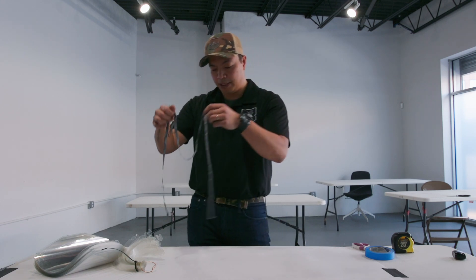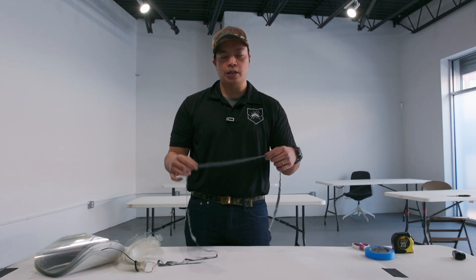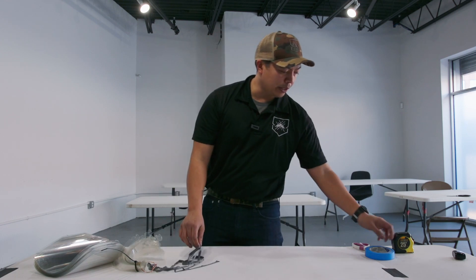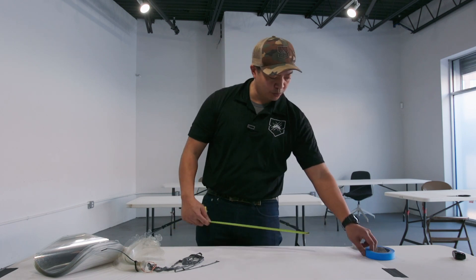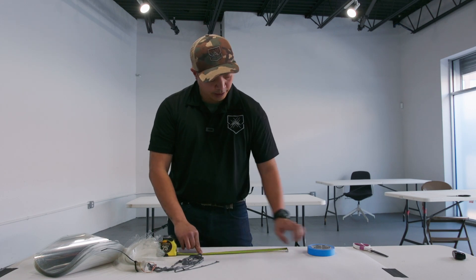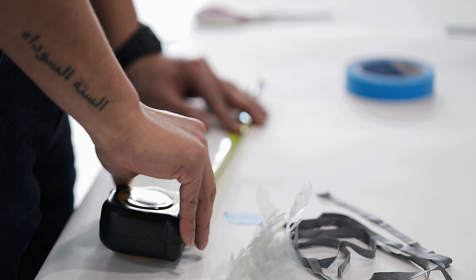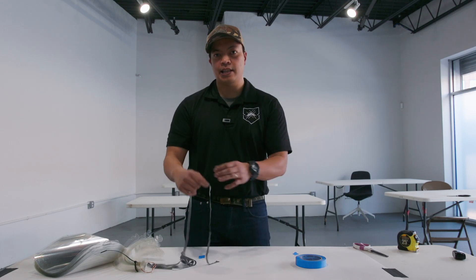We have the elastic pieces here. We're going to have probably two different types of elastic: one is a fabric type and one is more of a rubber band type. This one I'm holding right now is more of the rubber band type. For this one we are going to measure out 14 inches of length. If you're going to get the fabric style elastic, you're going to mark off 16 inches in length.